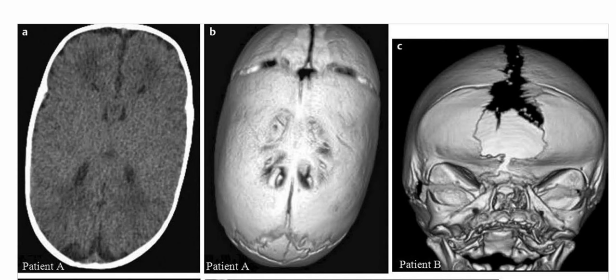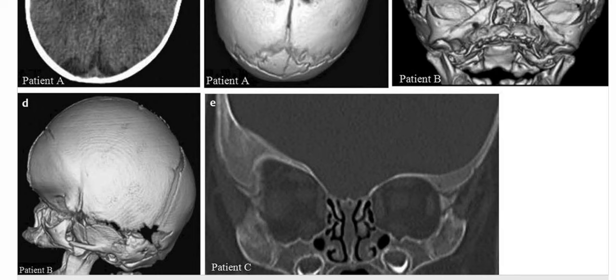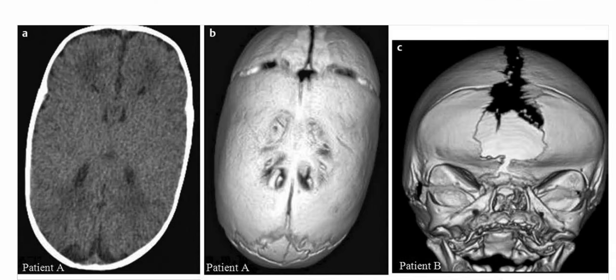These are images of three newborns and infants with head deformities. On the axial and 3D reformatted CT scan images, a 4-month-old boy reveals scaphocephaly and premature closure of the sagittal suture.